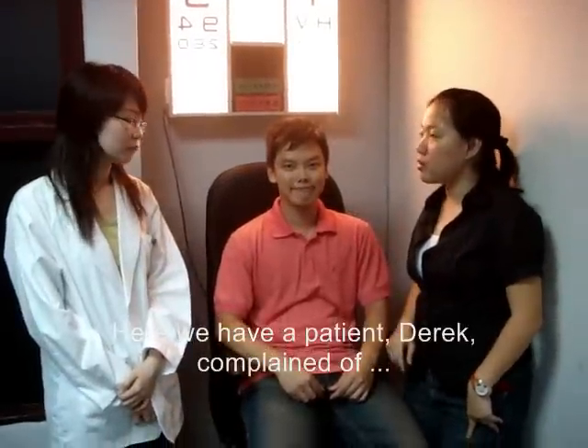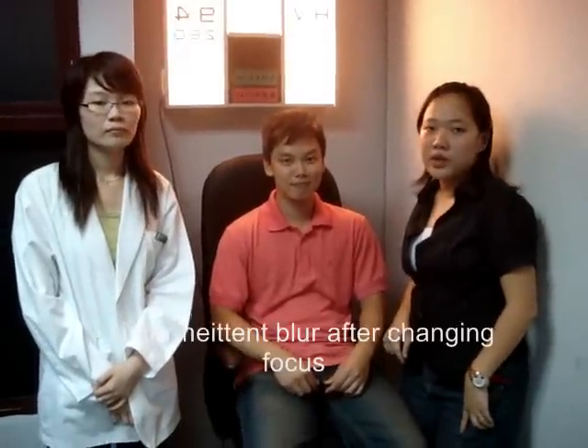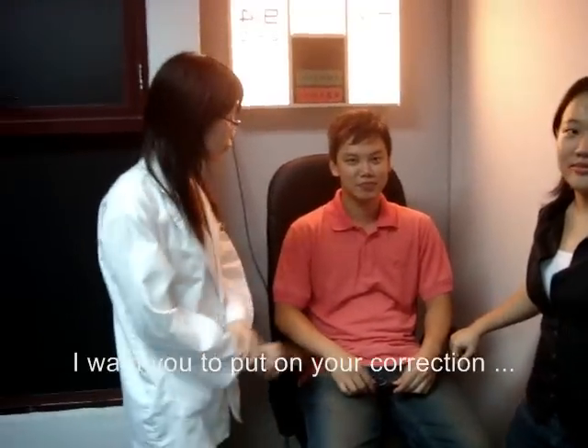Here we have a patient, Derek, complaining of intermittent blur after changing focus. Hi Derek, I'm Jessica. I want you to put on your glasses and sit comfortably and relax.